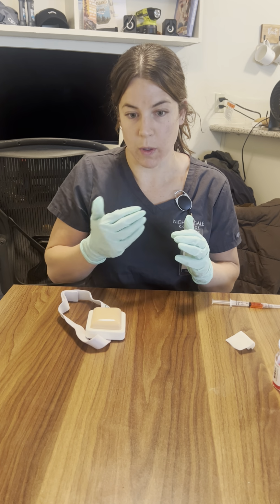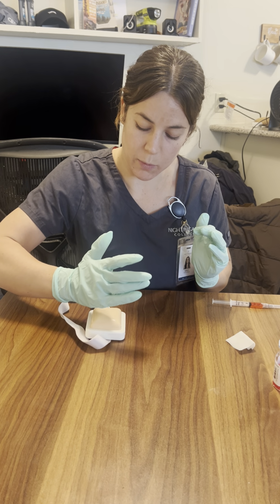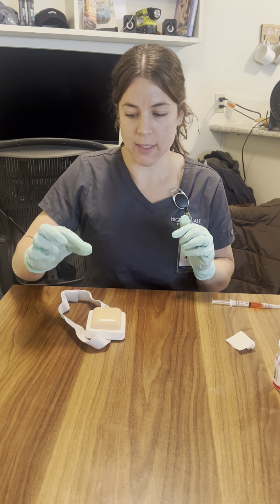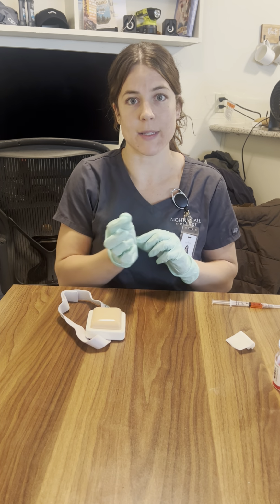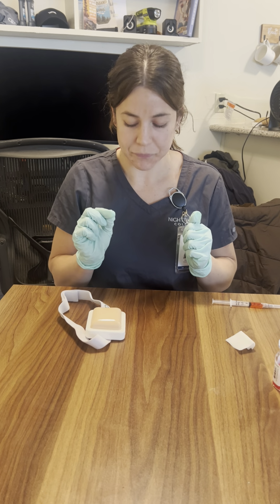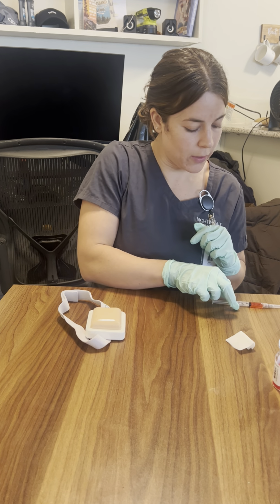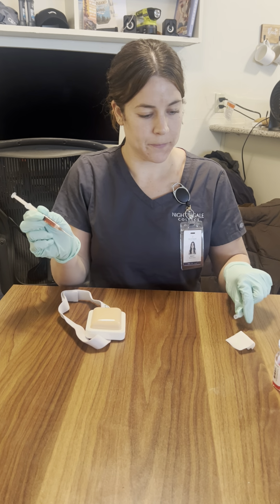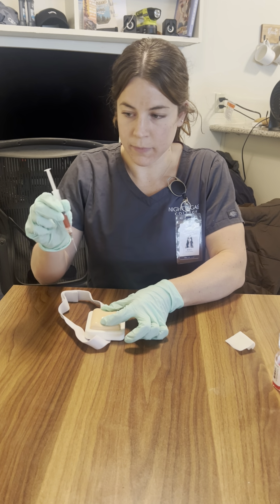So what we're going to do is when we administer it, we're going to use the heel of our hand, not on the injection site, and we're going to kind of create tension and traction to help with that. And we're going to take our 2 fingers, making sure we're not touching where we're going to inject, and kind of pull apart, pulling the skin taut to alleviate some of that pain of the initial stick. We want to make sure we're doing that with our non-dominant hand. So now that it is dry, I will go ahead and take the needle. I will uncap it. With my non-dominant hand, I'm going to pull apart.